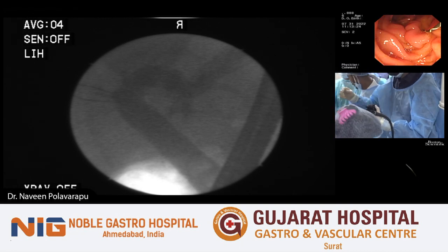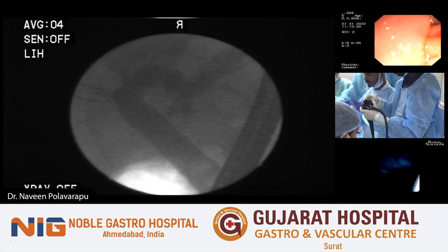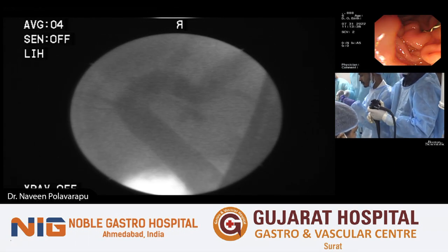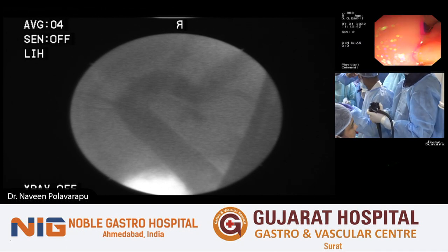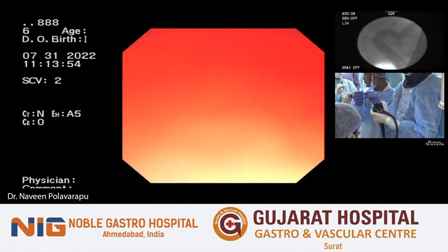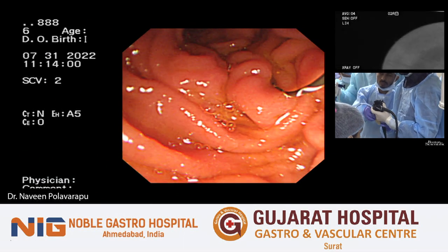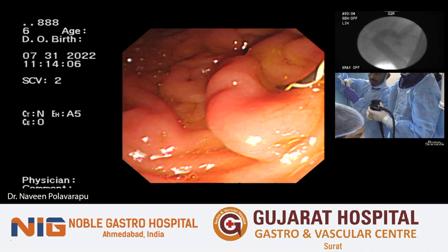Spy scope, please. No need for that, it's got a good enough opening there. Now, I think the audience asked a question about whether we need to do a sphincterplasty every time you put in a spy scope. Not necessarily. If you have a good sphincterotomy, that should take us through. The spy scope size is about 10 French, which is 3.3 millimeters. So if you can get a 10 French stent in, we should be able to get the spy scope as well. A good sphincterotomy should be good enough, and in this case, I see that there is a good enough sphincterotomy there. So I'm not going to go for any sphincterplasty in this case.